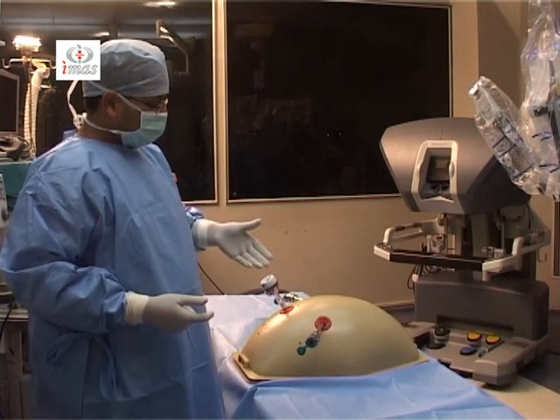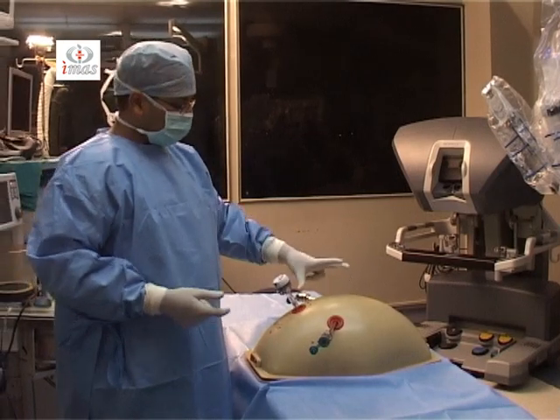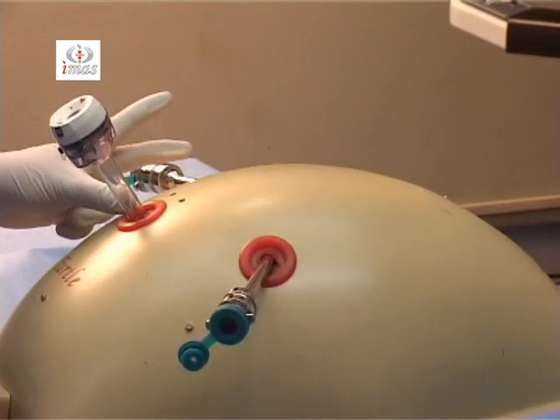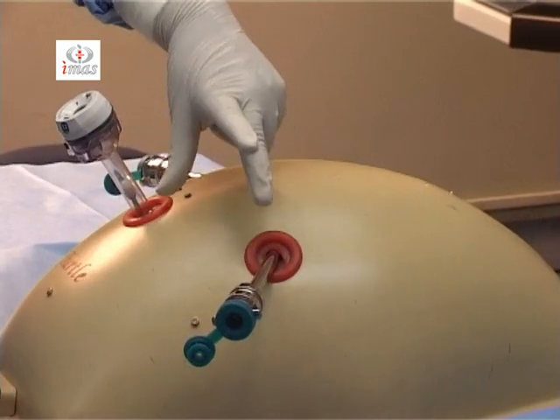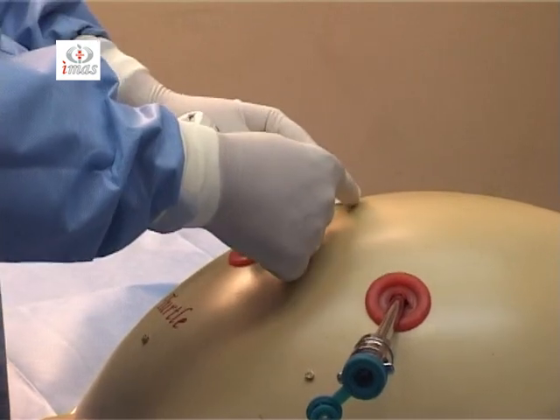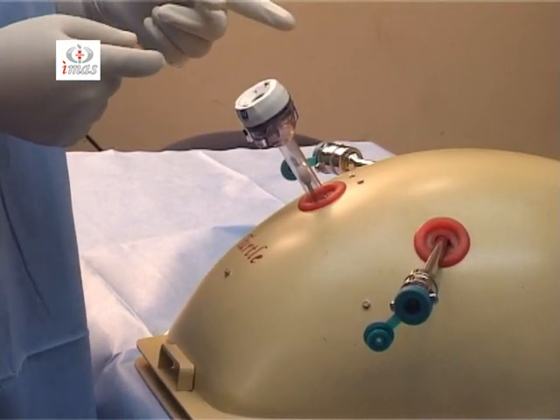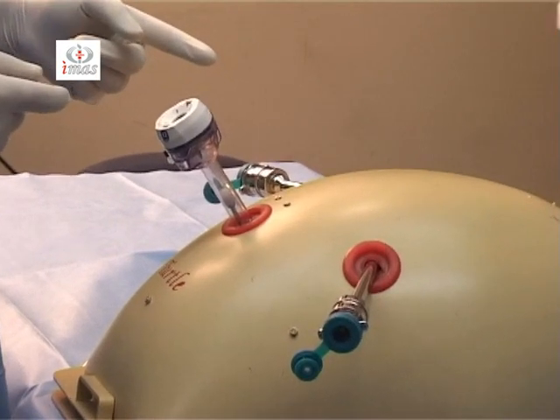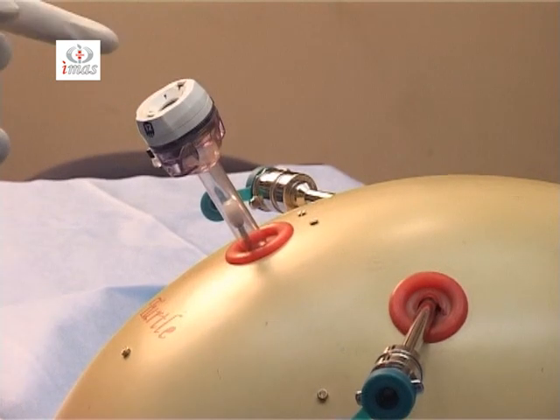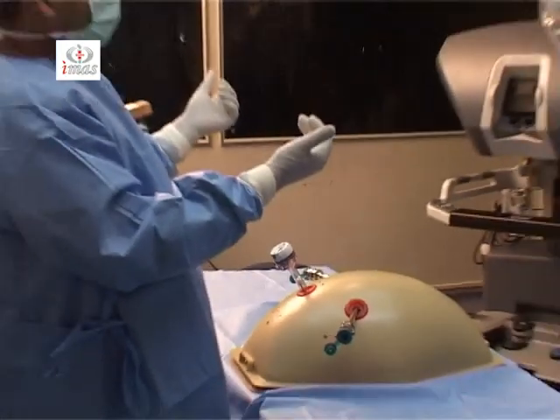This camera port is placed at least 20 centimeters from the target anatomy. So this distance from target anatomy is 20 centimeters. This distance is 8 to 10 centimeters. This distance is 8 to 10 centimeters, and they form a triangle, and this base of the triangle is facing the patient cart. So these principles have to be kept in mind in order to avoid any external arm clashing and to provide for a good docking. So now I'll ask the patient cart to come forwards.